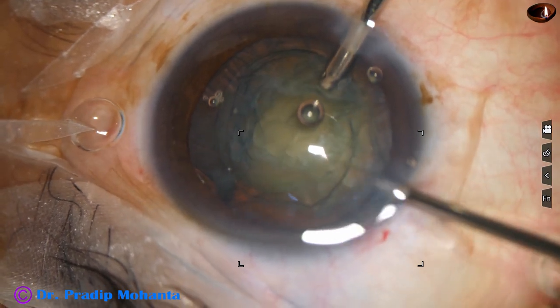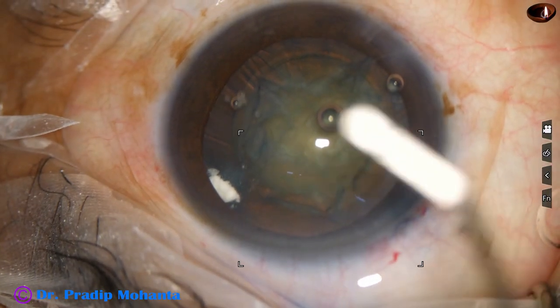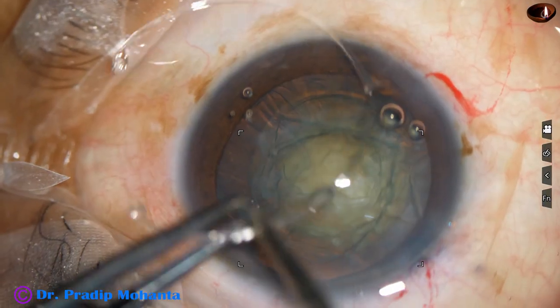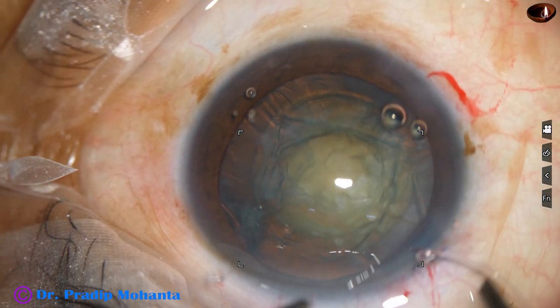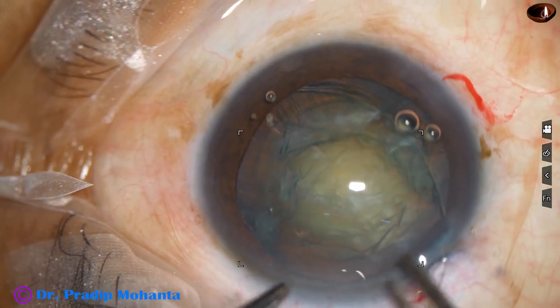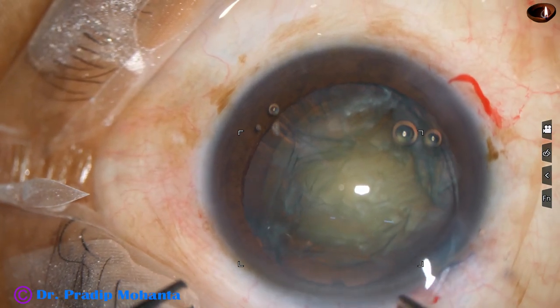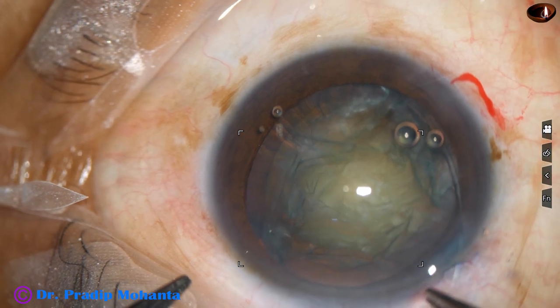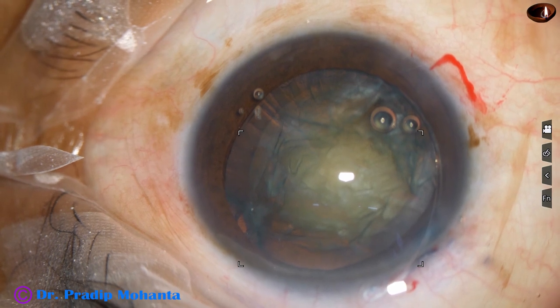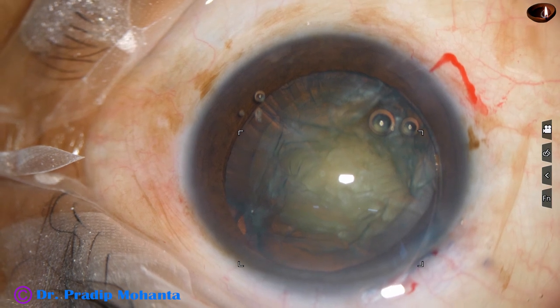I am careful not to cut the iris tissue. Viscoelastic substance is injected and now my plan is to implant a capsular tension ring. The capsular tension ring goes in the capsular bag and supports the dehiscence area nicely.